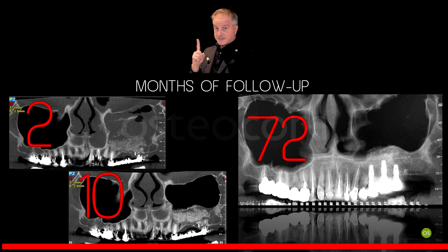So, from the ethical point of view, you should not do a CBCT to evaluate the work of somebody else unless that patient has symptoms and signs, and the CBCT most probably will change the diagnosis of that patient. So your CBCT should have a justification.